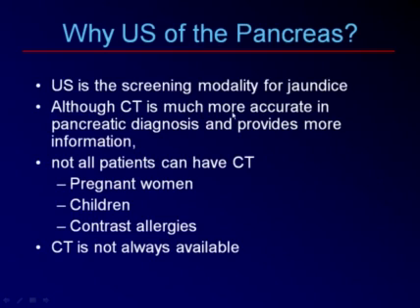Now, although CT is much more accurate in pancreatic diagnosis, and also MRI now is a wonderful modality, and they provide more information for us, we have to remember that not all patients can have a CT. For example, pregnant women, children, patients who have contrast allergies, who may not want to take the risk and undergo steroid prep, because a certain percentage of those patients break through with anaphylactic reactions. So in these cases, we should be prepared to do a full, proper evaluation of the pancreas.